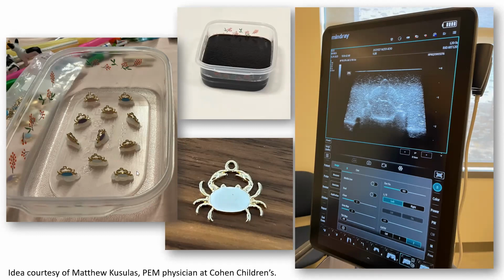There are two things I could have done with this. One is I gave them 5 minutes and they had to just find as many as they could. And in order to find them, this is what it looked like on ultrasound. So you had to be able to show me this kind of crab. Use a linear probe, and then you just scan. And if they weren't fully on target, it really taught good fine motor skills. And so that was really fun.